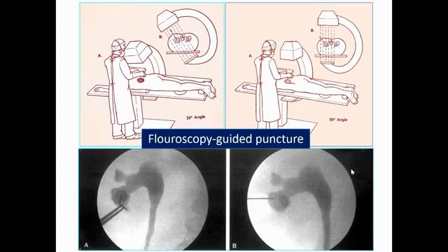However, you all will agree that fluoroscopic guided puncture has its own challenges, and it is not always possible to identify the posterior calyx, especially in patients with complicated pelvicalyceal anatomy, in staghorn stones, and many times it is simply a matter of guesswork how you are entering the pelvicalyceal system. And as soon as you enter and you get water, you are just happy that you are in.